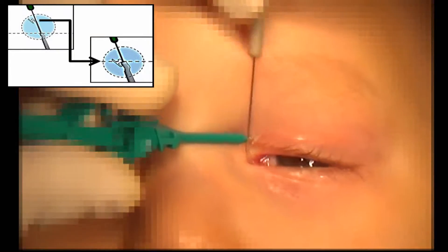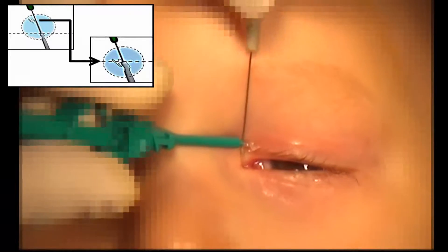With the metal guide still in the lumen of the sleeve, proper location of the end of the Master Ka can be confirmed with metal-to-metal contact. By holding the fixation plug firmly against the punctum and carefully withdrawing the metal guide one to two millimeters, the silicon sleeve can be guided further into the canaliculus by a similar amount. This process can be repeated several times until the fixation head reaches the punctum. However, if there is any risk for premature expulsion because the stent still appears too long, then this Master Ka stent should be removed and the procedure repeated with a shorter one.